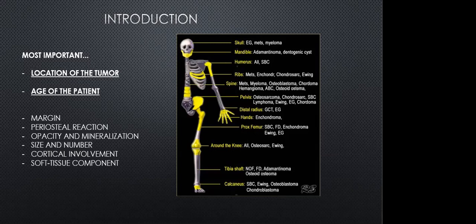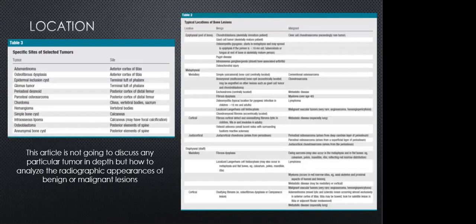Existem inúmeras situações de lesões benignas ou malignas em diferentes tipos de ossos, ossos tubulares, ossos achatados, vértebras, mas não é a radiografia, muitas vezes, que vai dar esse diagnóstico histopatológico. Nós vamos ter ferramentas para falar se uma lesão tem características de ser benigna ou maligna, para a gente prosseguir a investigação.